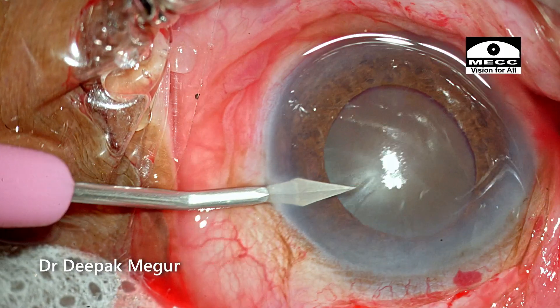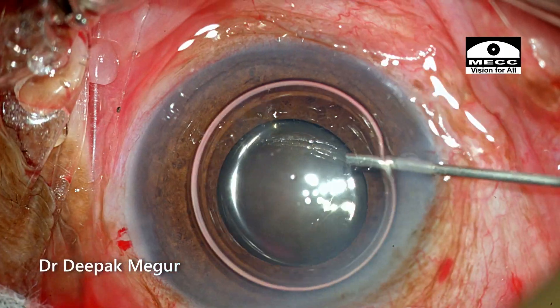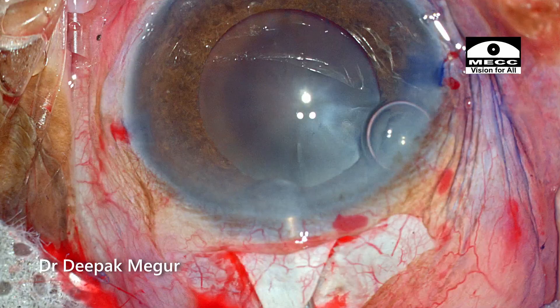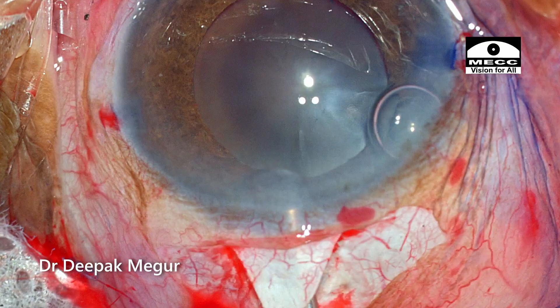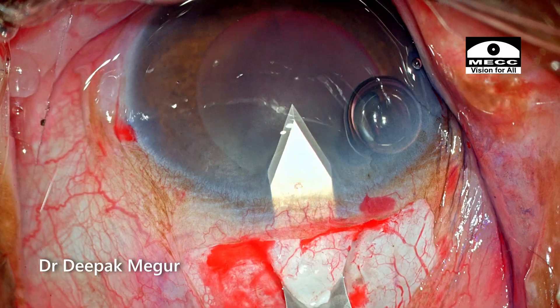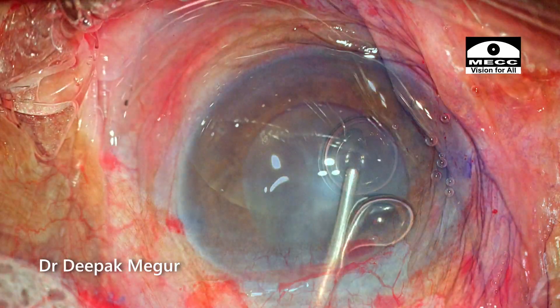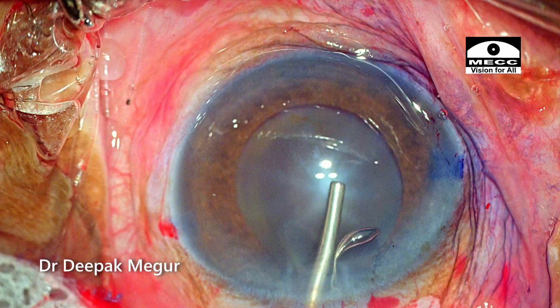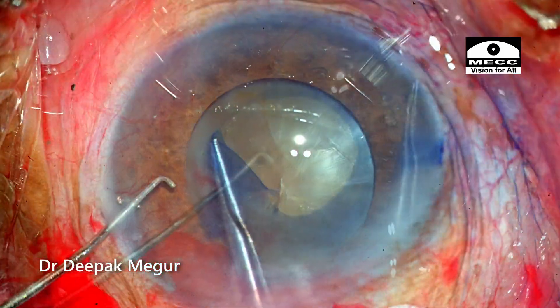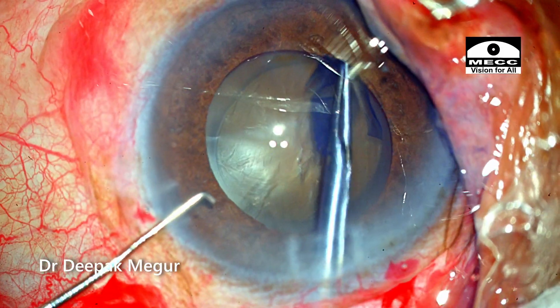Once the tunnel incision is created, it's time to deal with the anterior capsule and create the capsulorhexis. The capsule is stained. I enter the main incision, OVD is injected into the eye, and using forceps I perform the capsulorhexis. The capsulorhexis is done.